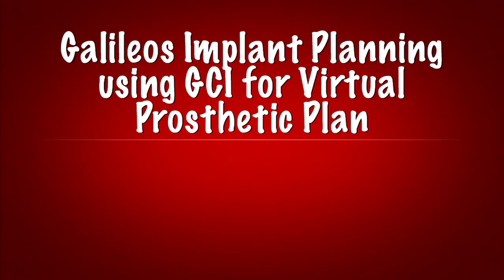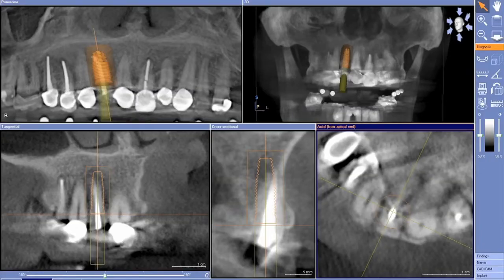Let's move forward and take a look at our Galileos implant plan. In this case, we took a 3D scan of our patient and planned for a 3i 4mm by roughly 13mm implant.